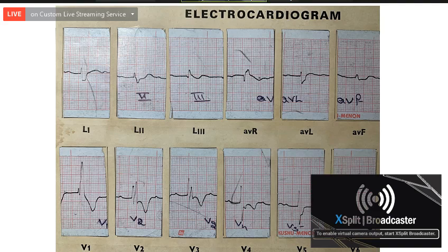So all put together, I would start thinking that the axis is more towards the right than onto the left. Right axis. So there is right axis deviation. Axis may be around 120 or 140, 150, 120 would be more correct. So a patient has got a QRS axis of 120 and first degree heart block, and also having a right bundle branch block pattern.